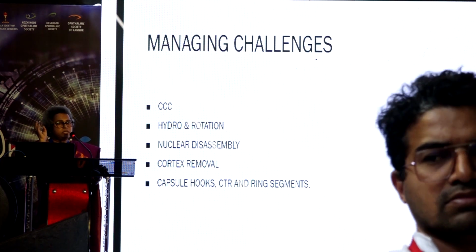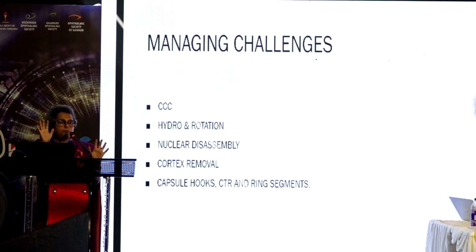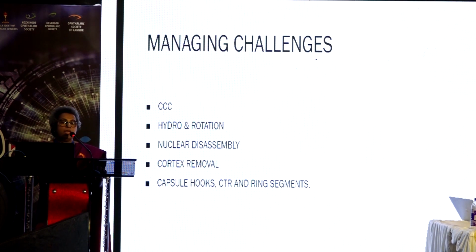I would suggest that you stay calm, always pressurize the chamber adequately, not over-pressurized, not under-pressurized, and shift to either a microrhexis forceps or an Utrata forceps if that is all that is available to you. Always support the lens with a second instrument.